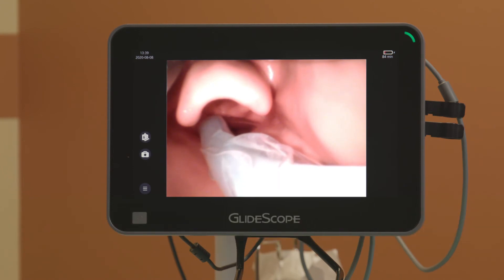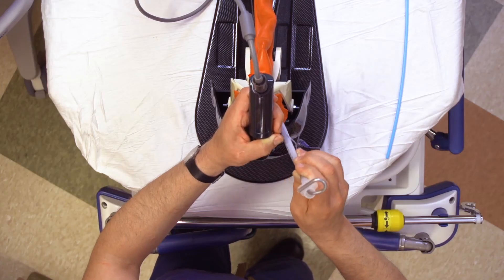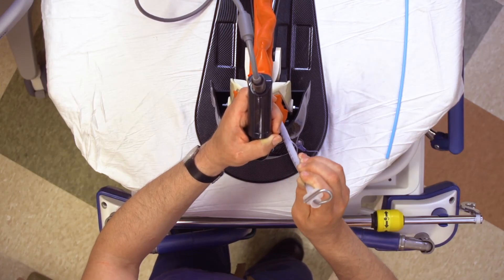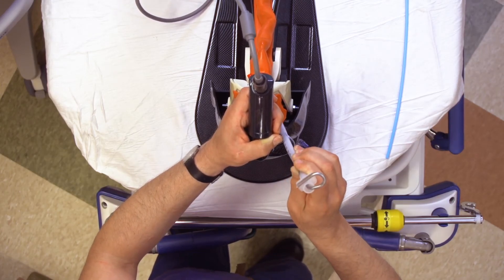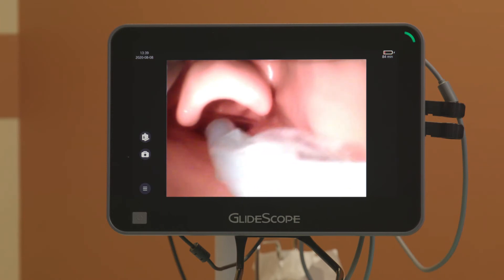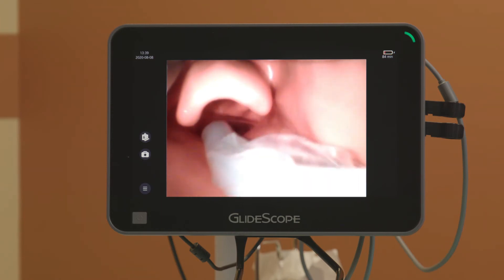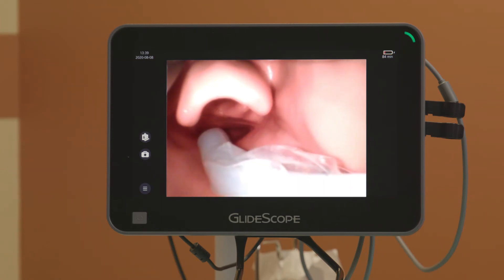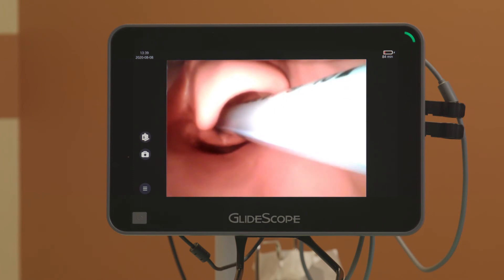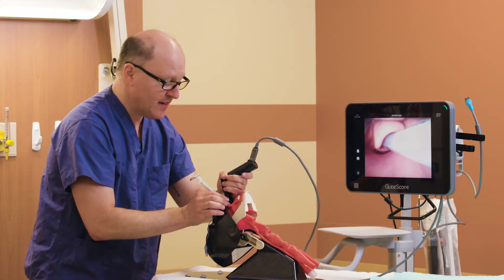What I'm doing is I'm toggling in the right corner where the right dental arch allows me to pivot backwards. I'm pivoting backwards and I come up from below and I watch it go in.